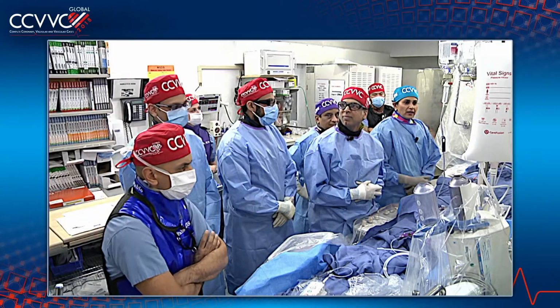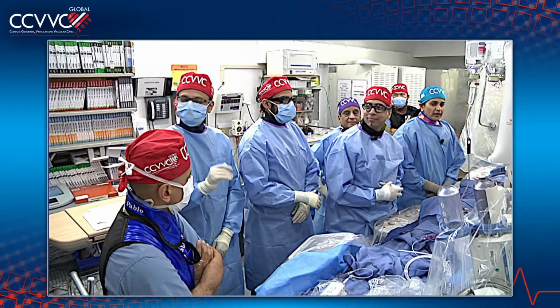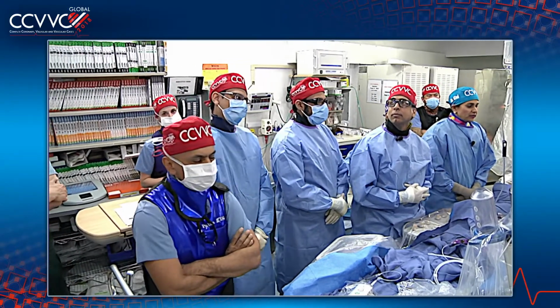Beautiful. Welcome everyone, and Anu will start the case now. Good morning everybody. If you can see case number 1, before we start, you see myself and Nitin Barman will be the operator. We have our 2 fellows here, Mohammed and Neeraj, and the entire cath lab staff with us.